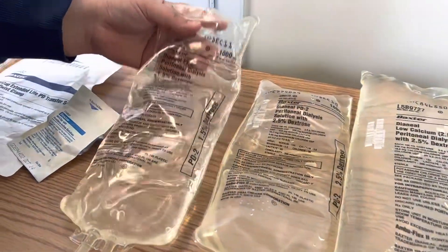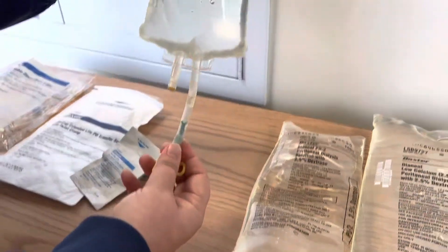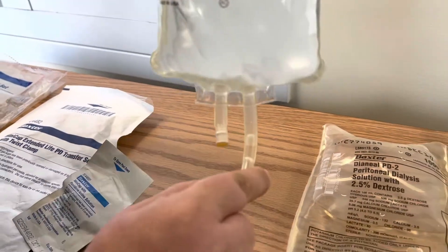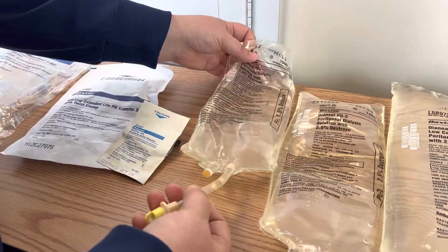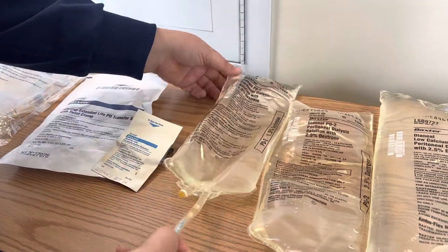And then your L is leaks. Not only do you want to check the bag for leaks, but there's a little flange inside that you're going to have to crack and break, and sometimes that may crack the tubing. So when you crack it and you're ready to give it, always make sure it's not leaking at the site.